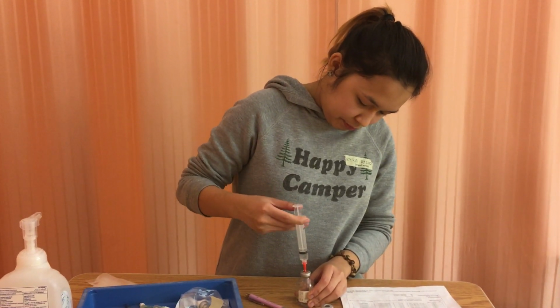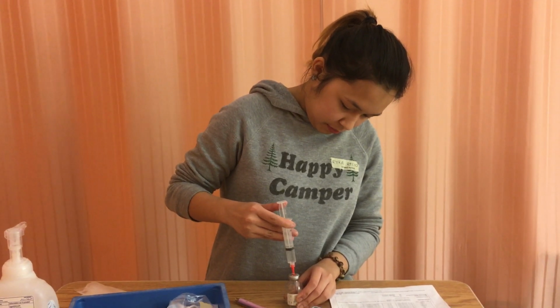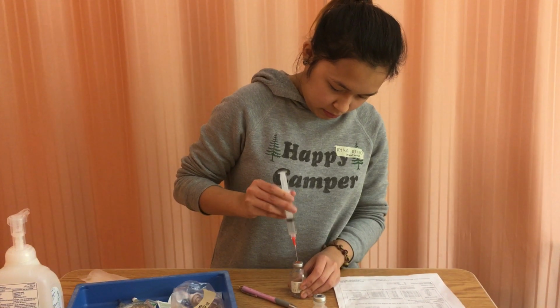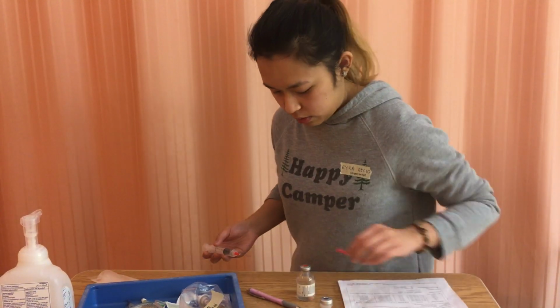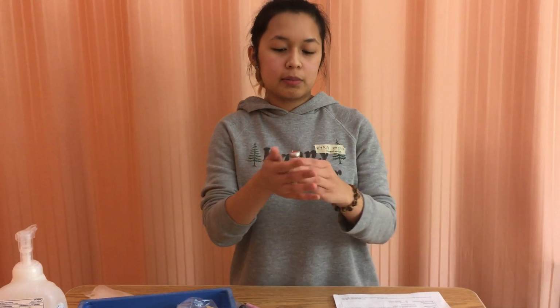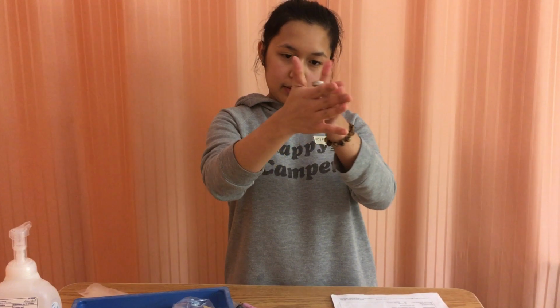So now I'm just going to pull up some air. At this point, I'm going to roll my medication gently again between my palms so that the medication is well mixed.